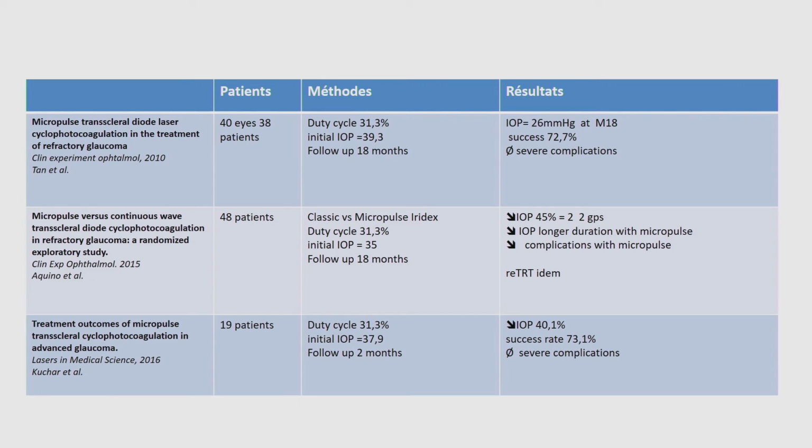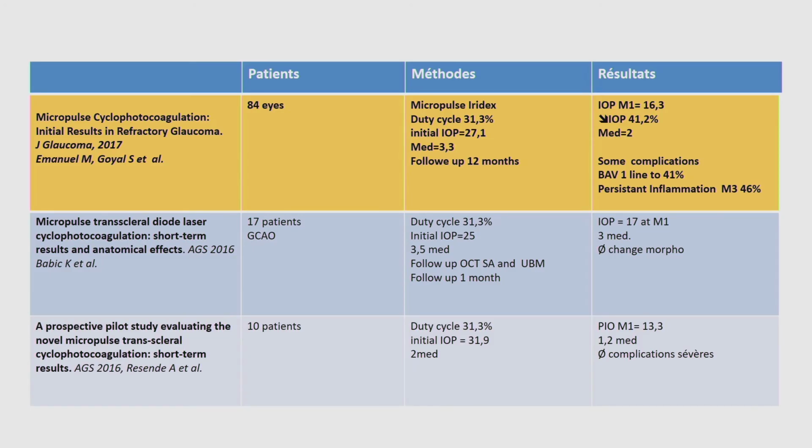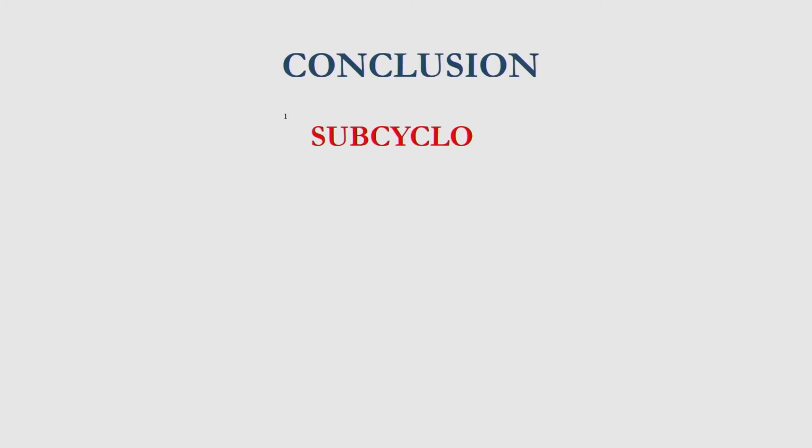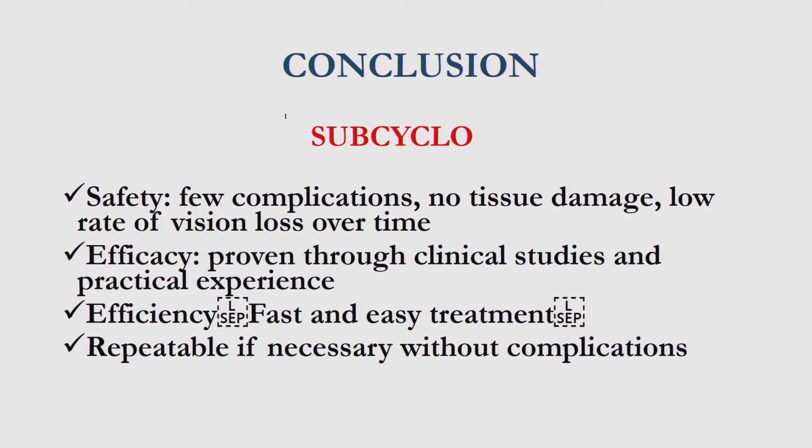But a recent study showed some persistent inflammation with the Iridex.